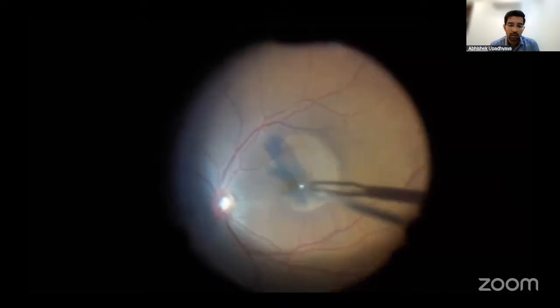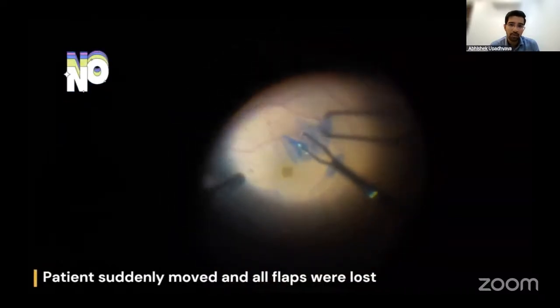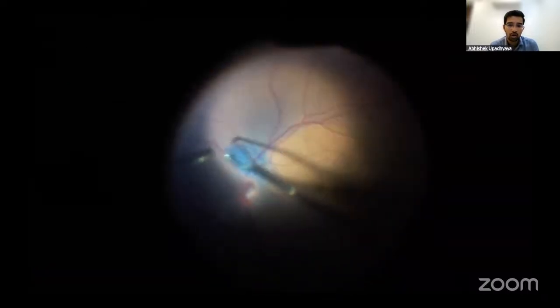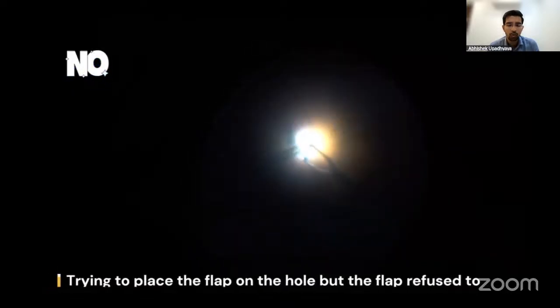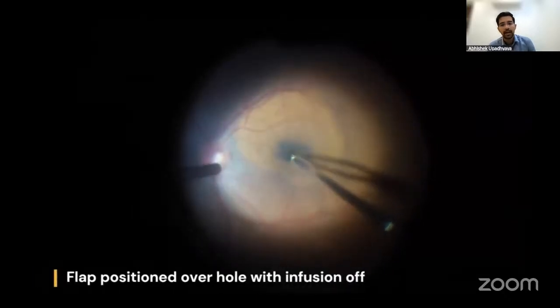As you can see, I've made very long flaps, and the patient suddenly moved and the flaps got engaged in the ILM forceps. Because of that, all the flaps were lost. According to my initial plan, I wanted to leave flaps over the macular hole because the patient was very unwilling to return. So I wanted something that would work 100%. I was trying to place the flap on the hole, but I was not able to. I tried with the infusion off, but still, as soon as I would switch on the infusion, the flap would go away.